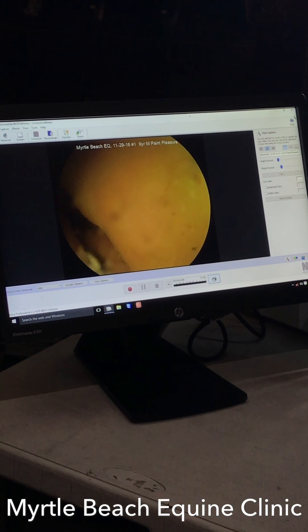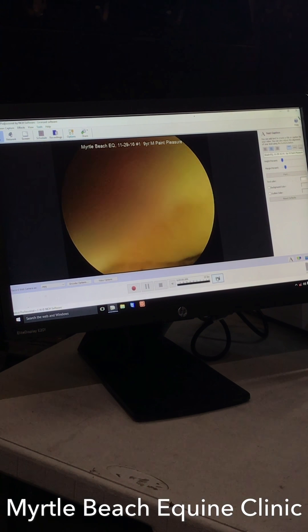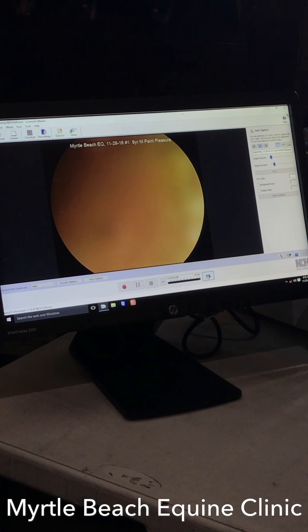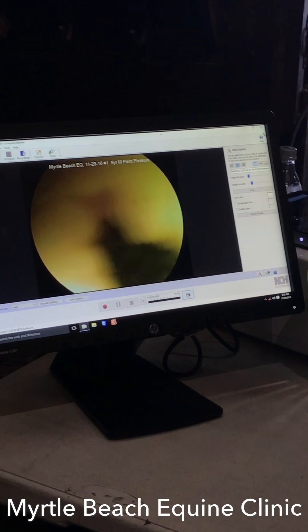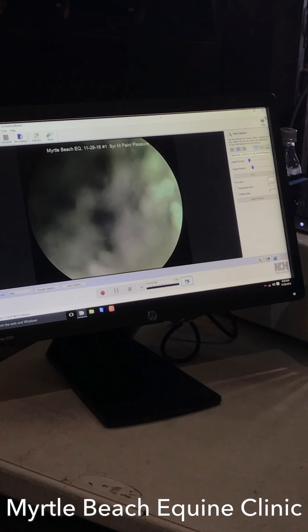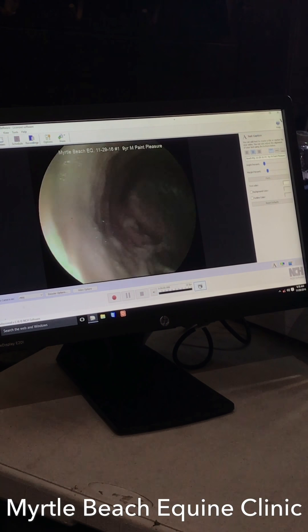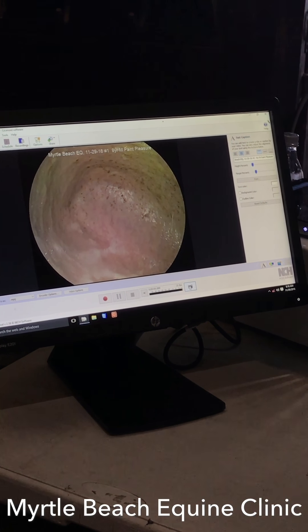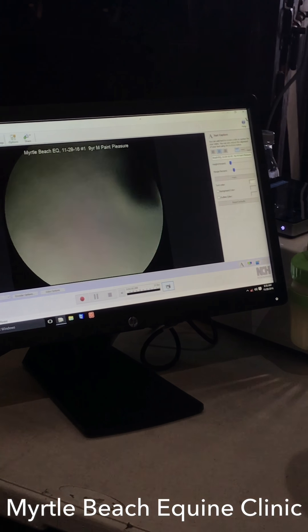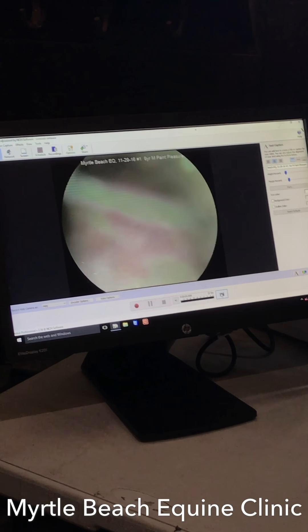What happens is you actually straighten things out and sometimes it goes a little bit further than you want. It's real easy to go too far. We're at the top again, which is what normally happens — looking straight up to the top part of the stomach. Go ahead and advance it in again. We want to get down there by the pylorus and take a good look.